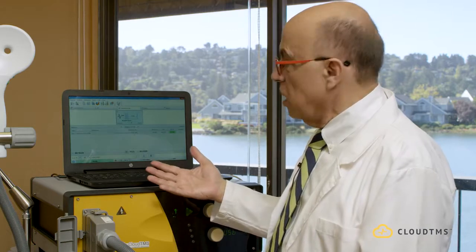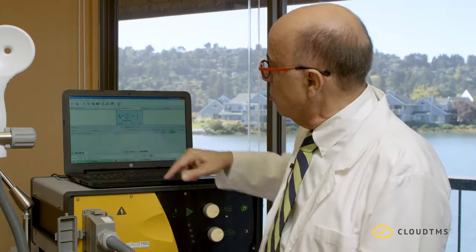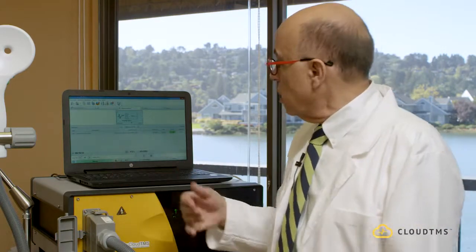It's going to stop for 11 seconds. And as soon as those 11 seconds are over, and it's timing, by the way, see it says 18 and 17 now, as soon as these 11 seconds are over, it's going to start stimulating again. And that's how you get the 19 minutes protocol.